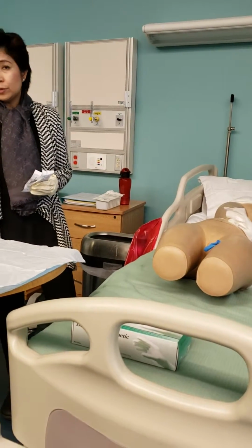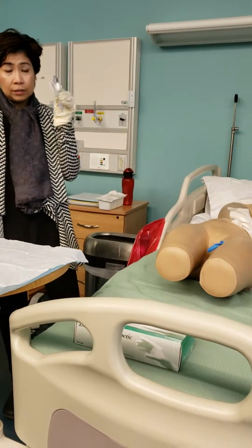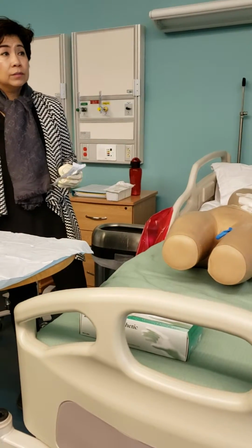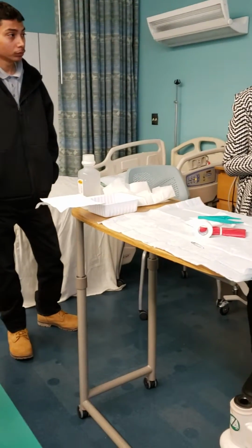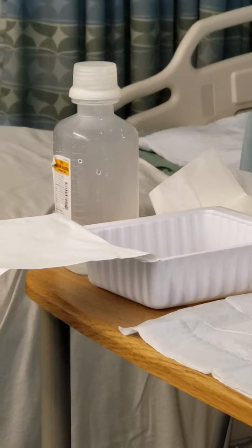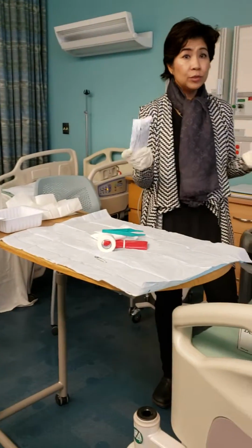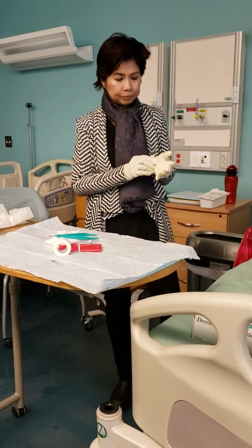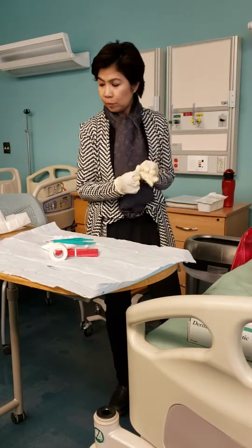And if they're allergic to betadine, and this is betadine, then make sure that you also have this on hand, because then you're not going to use it. And if the swab stick is not medicated, then that's a different scenario. I'm just using this if this is already medicated. So, for example, let me put this back.